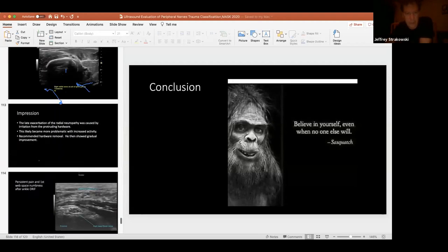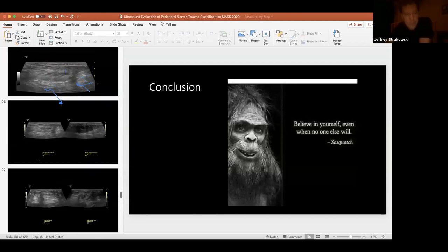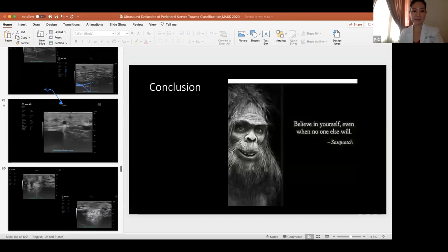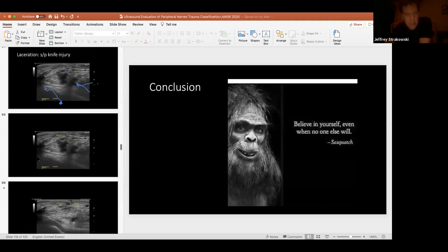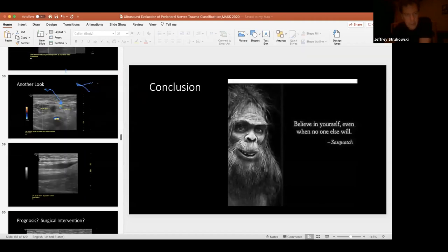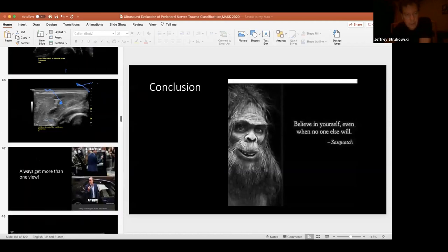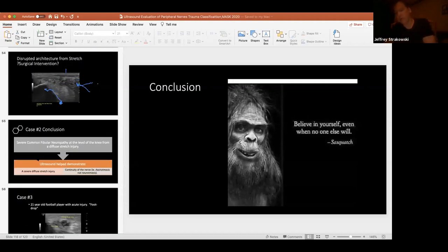Can you still see my screen? Yes, we can. Okay. I have one right up here somewhere where we're just seeing two fascicles. It's not a classic bifid, but that's very important. So what we're doing is comparing apples to apples and not apples to oranges, right? That's what we want to do when we measure.